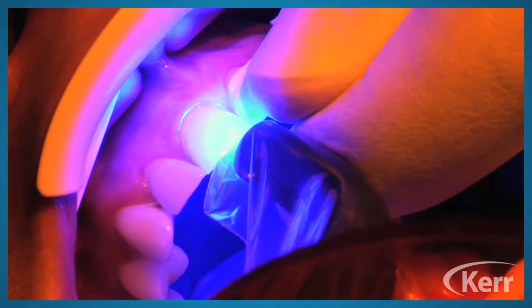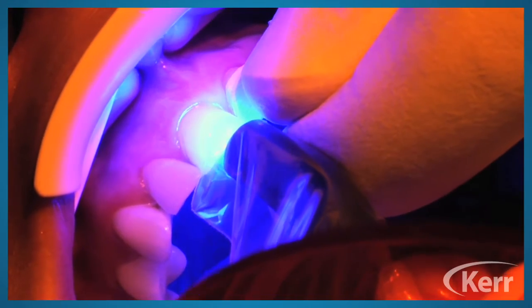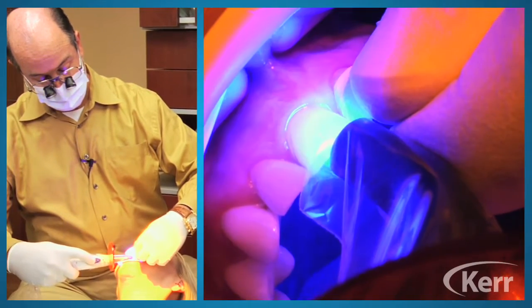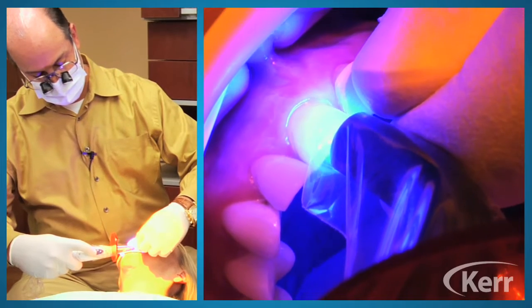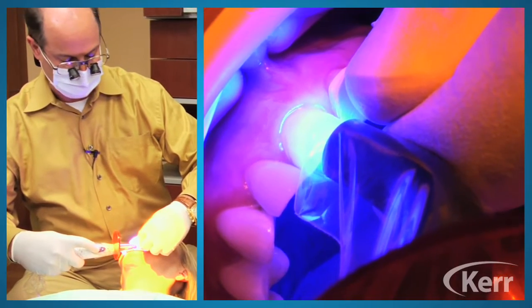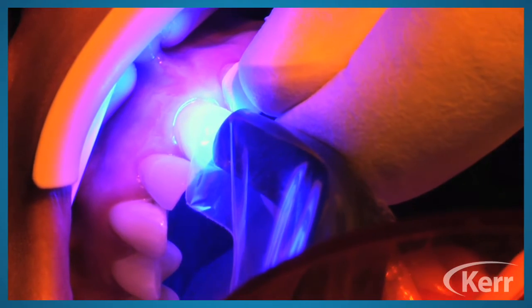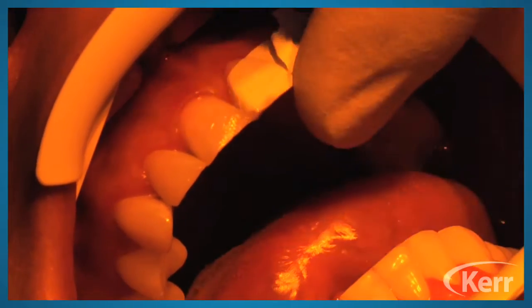I've put in the literature that I call the primer a necessary contaminant. I think that's a nice way of describing it because it's necessary, but if you didn't blow it, the solvent would be a contaminant to your bonding system. So a necessary contaminant is what I like to call the primer. So we've primed and bonded the tooth with one bottle. That's why it's a total etch one bottle system. And go ahead and light cure that.